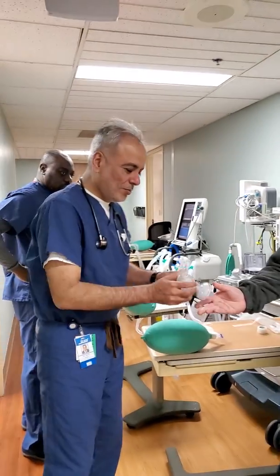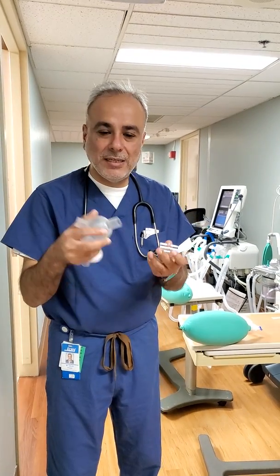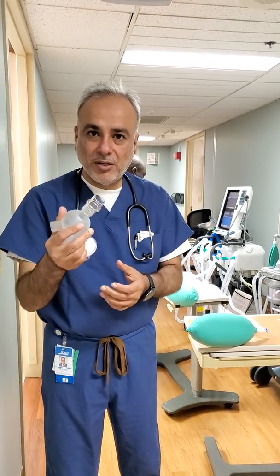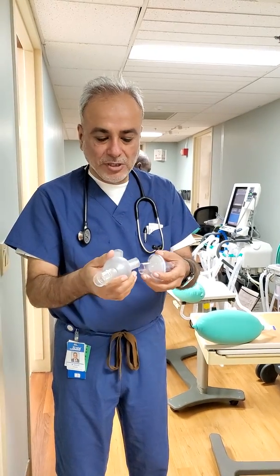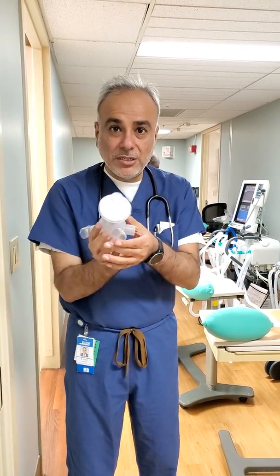So with this concept, what we've been able to do is this actually goes inside the inhalation as well as the exhalation part of the ventilator. And then these are the filters which can come together. This actually has 4 options. So we can have 4 connectors with one ventilator, and each connector can further be divided into 2 or more branches if we need to.